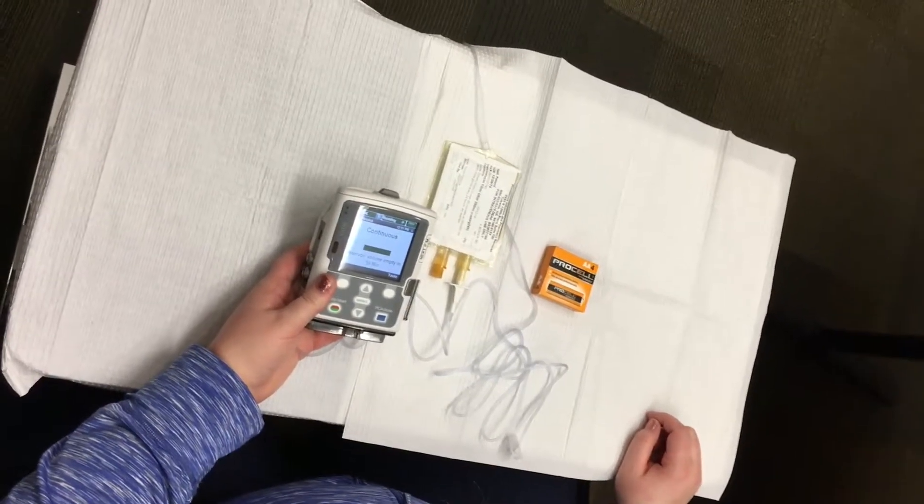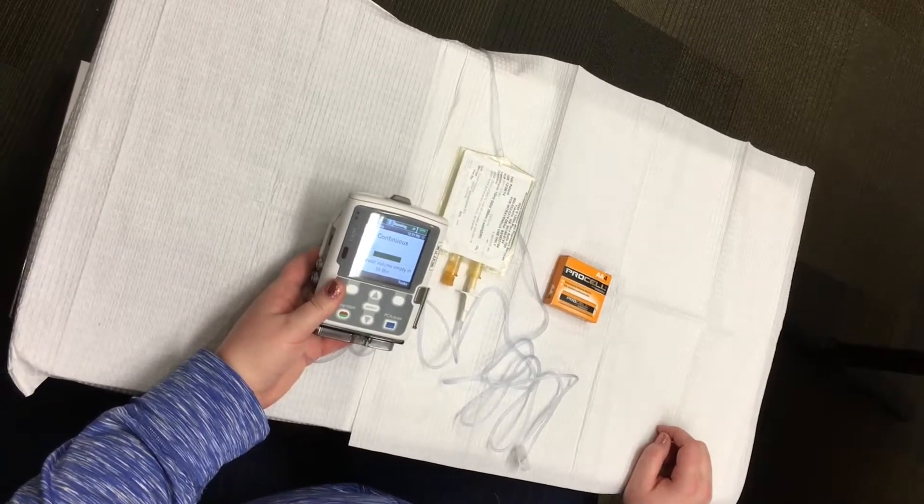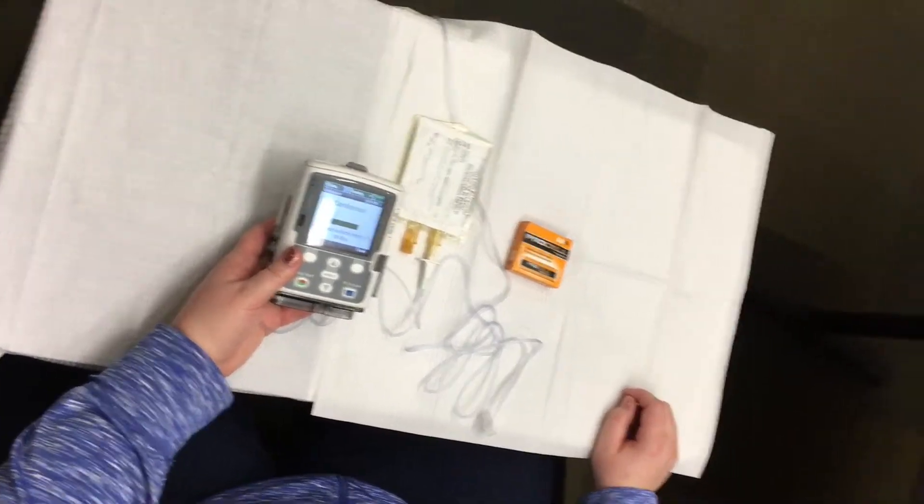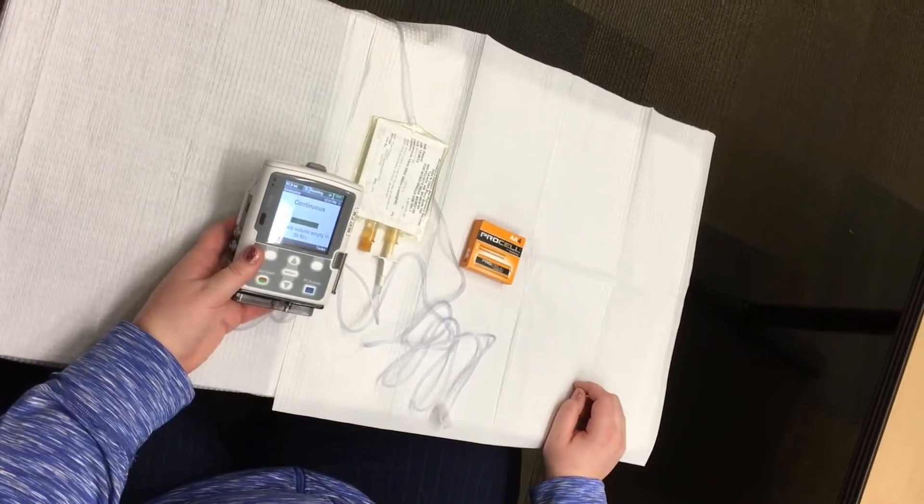This video is intended to demonstrate how to change the four AA batteries in your CAD Solus pump. Providence Home Infusion will supply you with all the batteries you need throughout your therapy.